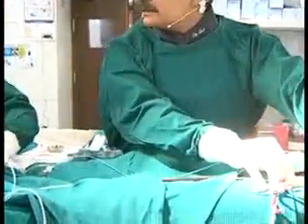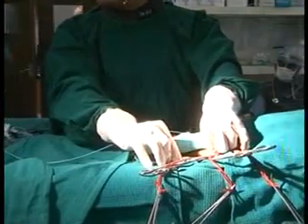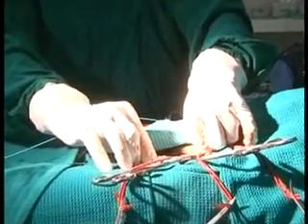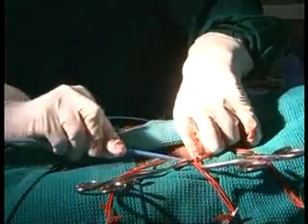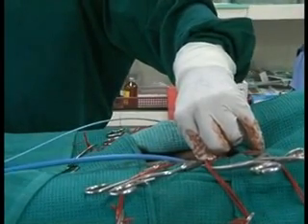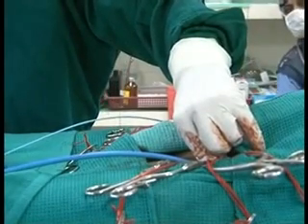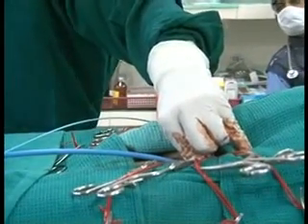Okay, that's right. Now bring that sheath, please. So this is a 14 French sheath. It is a little smaller than the device that went in. That was 18 French, but it may be enough to give us some hemostasis. Take the dilator out, please. Yeah. Bring the marker pigtail now. So next we'll bring a marker pigtail and place it there to know what length of extension we need.